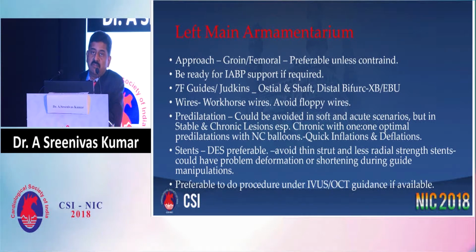Basically, we tend to use femoral a little more commonly than radial, especially for bifurcations where we are planning for 2 stents. But nowadays, if you are using all new material, we can still manage through radial also.